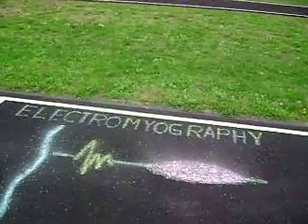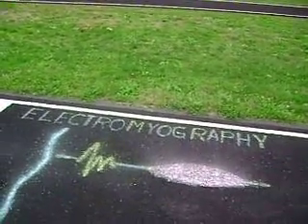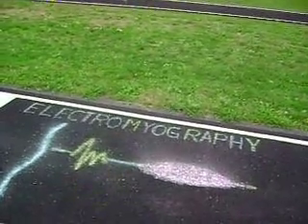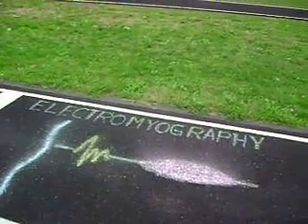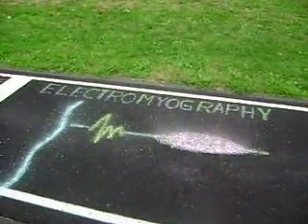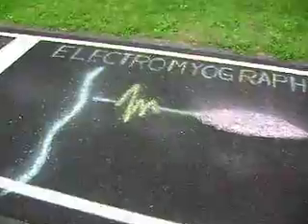In chronic neurogenic disorders, motor unit potential amplitude and duration are increased, and the percentage of polyphasic potentials is increased. And that is electromyography.